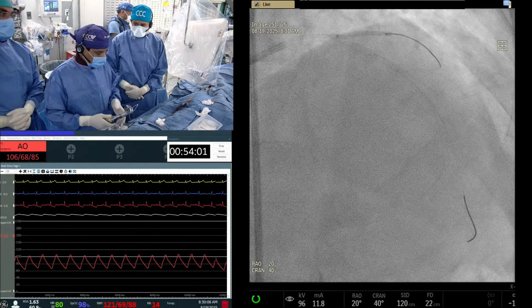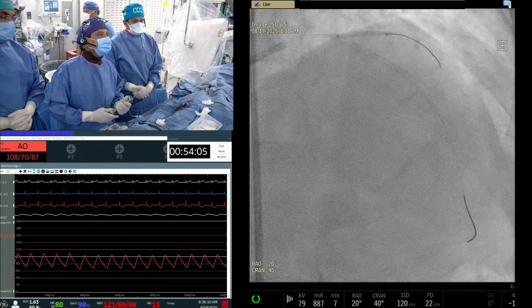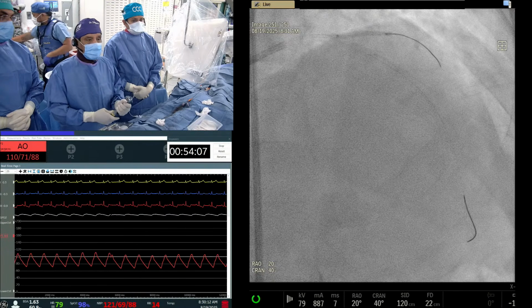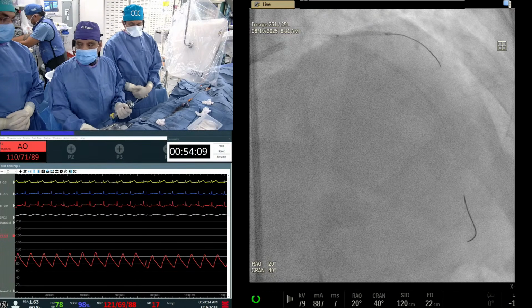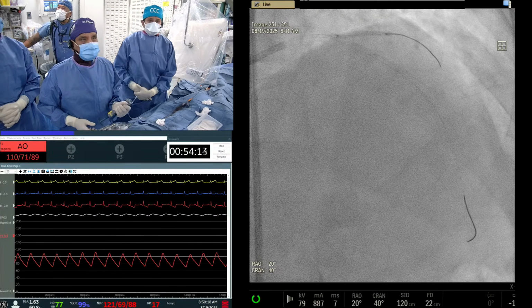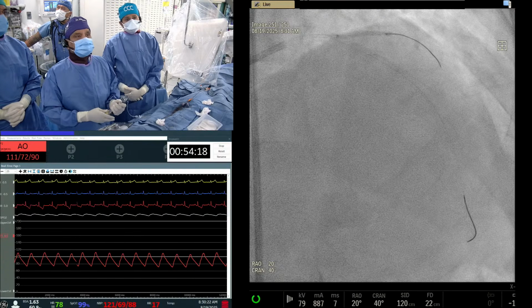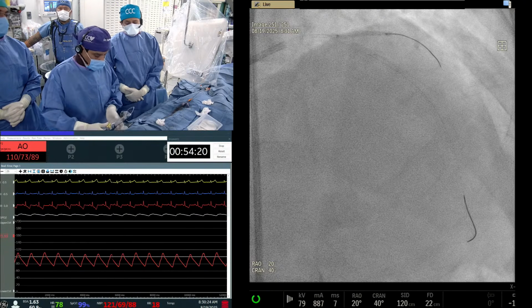Well, you want to zero? Tolerating better now. Again, it starts the EKG. The vessel is 3 millimeter or 2.5? Actually, approximately 2.5, like all the way approximately 3.5. I mean, the start of the IVUS catheter is a 2.5 vessel. So let's put a 2.5.